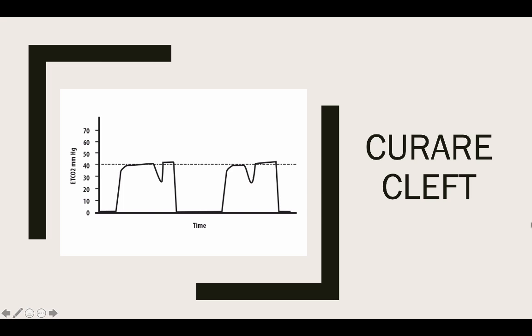Well, that's because their paralytic is wearing off. Their sedation is wearing off. If you ever see this, immediately sedate, immediately paralyze. If your patient is on a paralytic, immediately paralyze. If they're on propofol or etomidate or ketamine, some heavy kind of sedative drip, up that sedative drip. So we want to sedate, we want to paralyze.